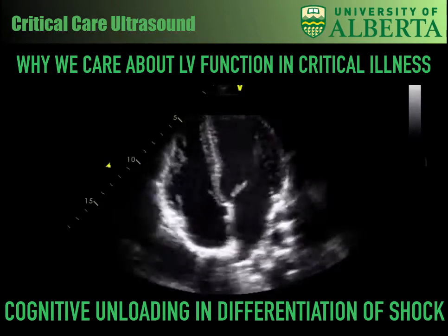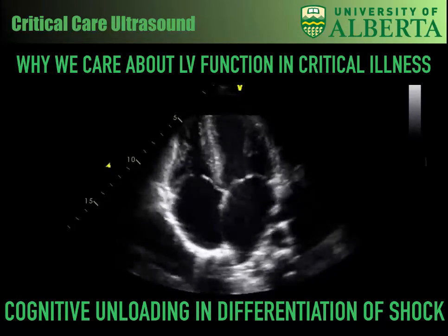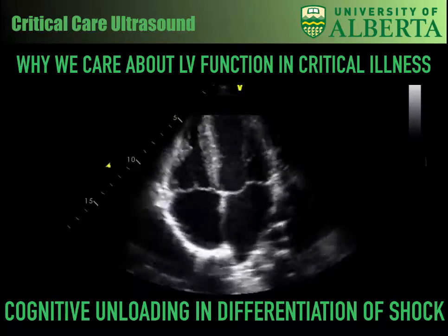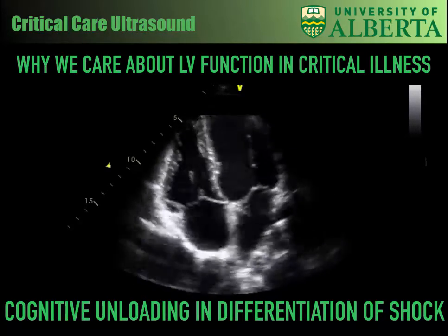It may also have an impact on cognitive unloading, such as finding normal biventricular function in the patient with shock, where this may support another non-cardiac cause of hemodynamic instability.